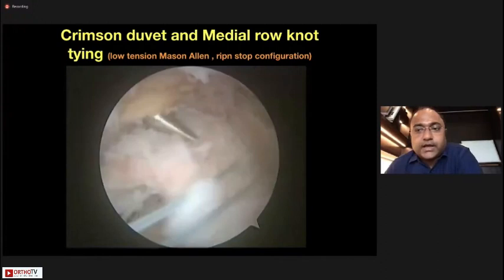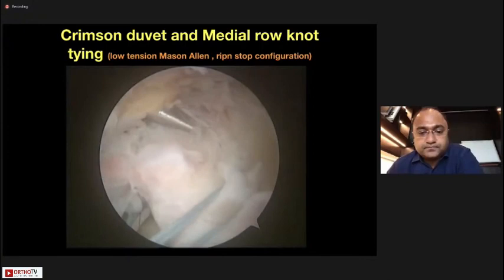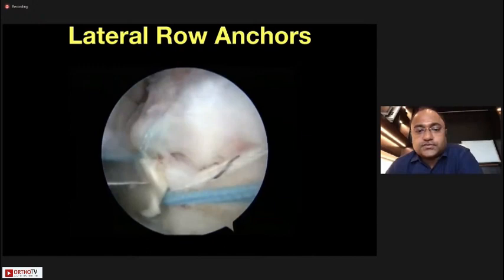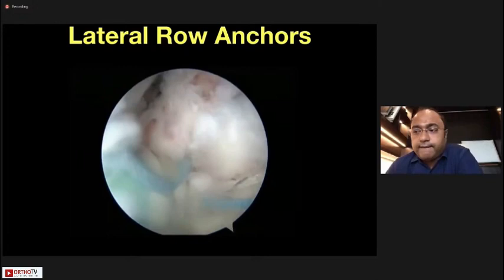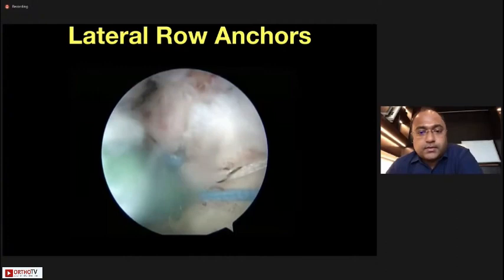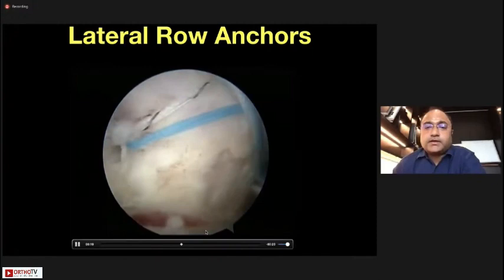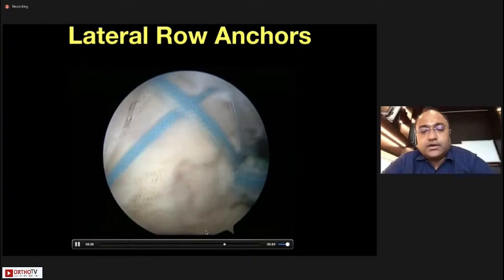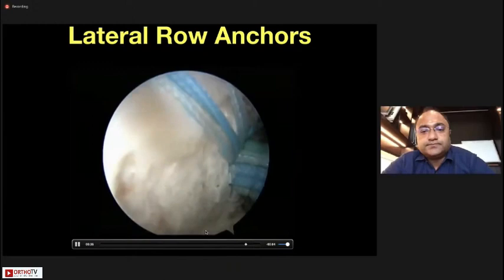Create crimson Duvet bone marrow vents. I adopt the principles of single-row and double-row repair — pass the stitches through the rotator cuff using antegrade and retrograde devices and start tying the knots. Then place the lateral row anchors; sutures from the medial row are loaded onto the lateral row anchors to achieve a suture bridge or W-configuration — a footprint repair where medial row sutures are passed through the cuff, tied, and the tied sutures loaded onto the lateral row anchors.